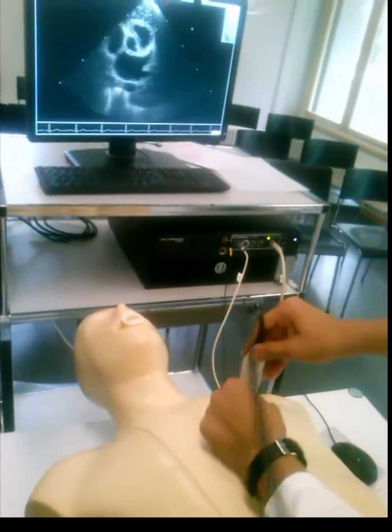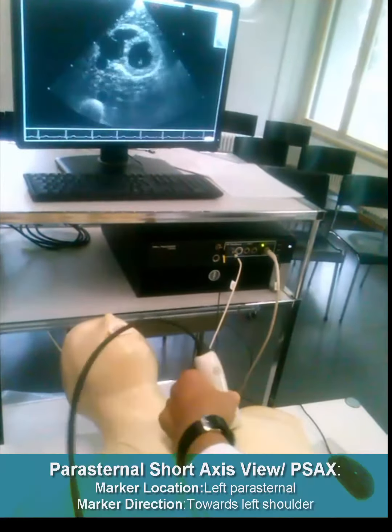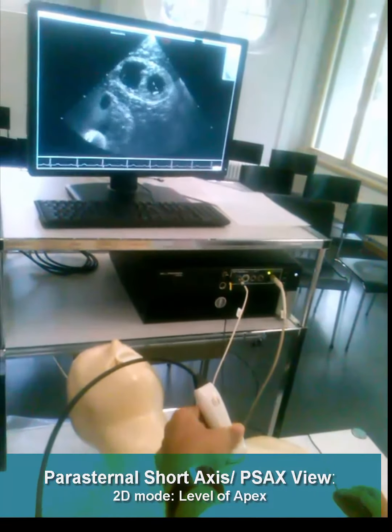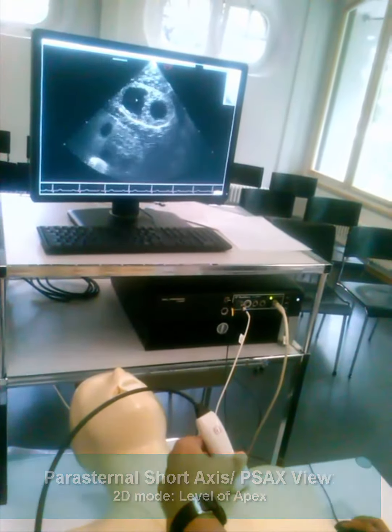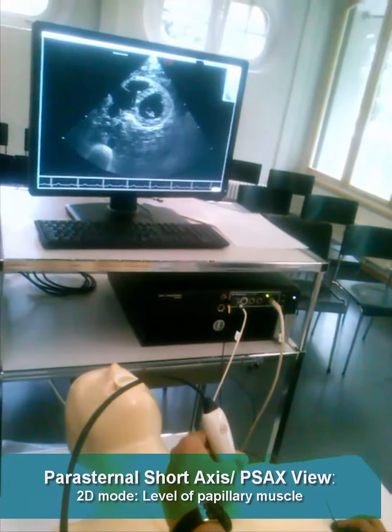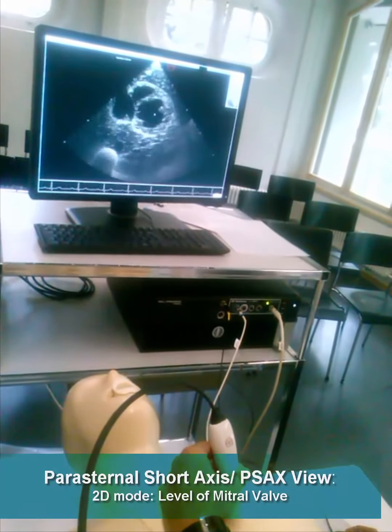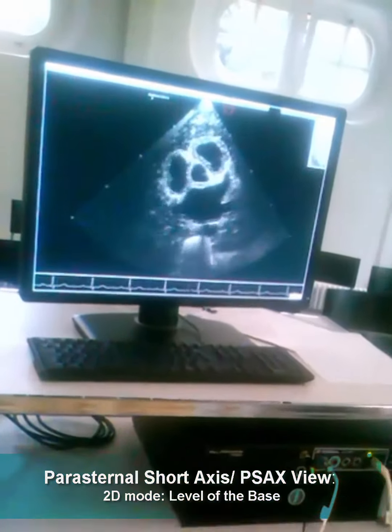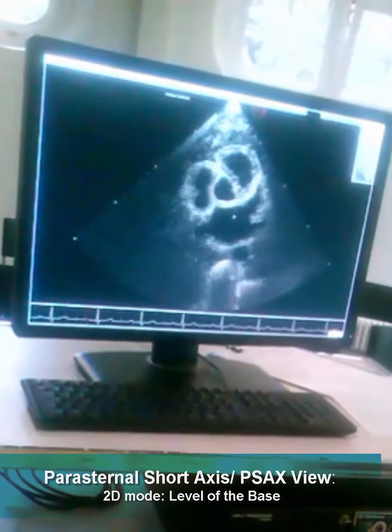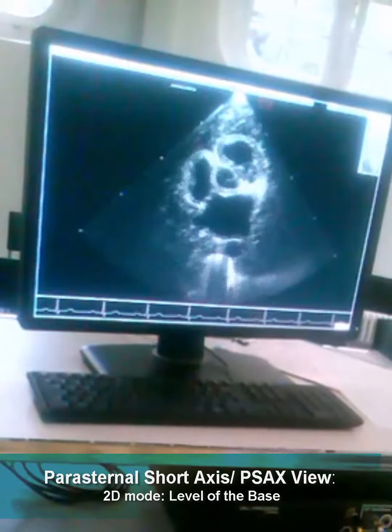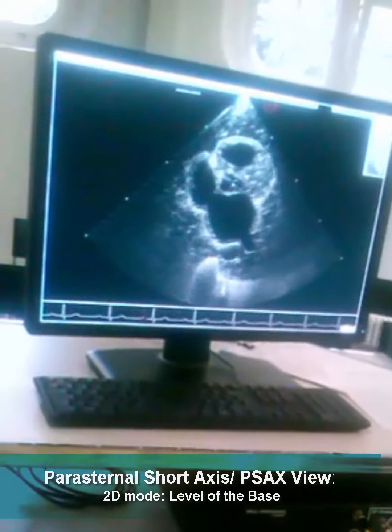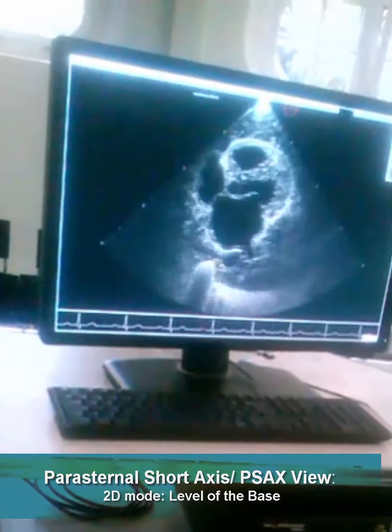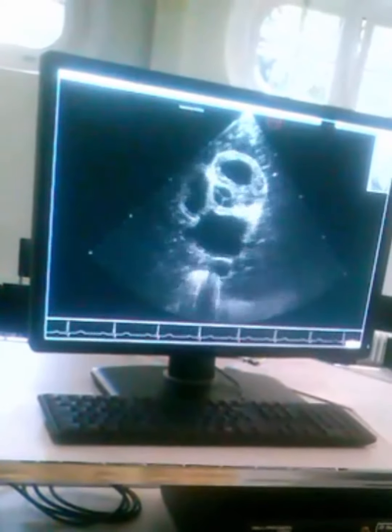We will rotate it to the left shoulder. We are now at the level of the apex. This is the left ventricle and this is the right ventricle. This is the level of the papillary muscle, this is the level of the mitral valve, and this is the level of the base. Here now you can see the left atrium, right atrium, and aortic valve.